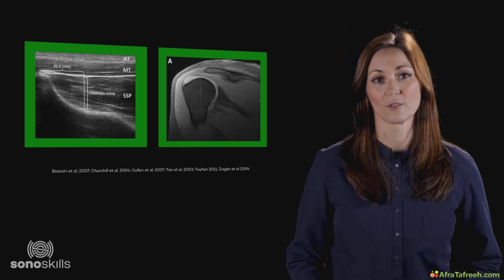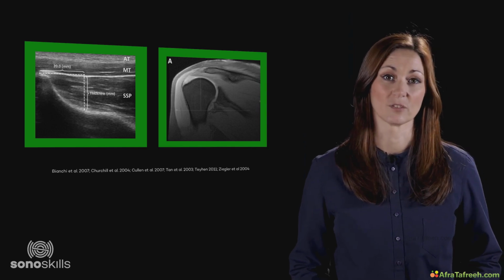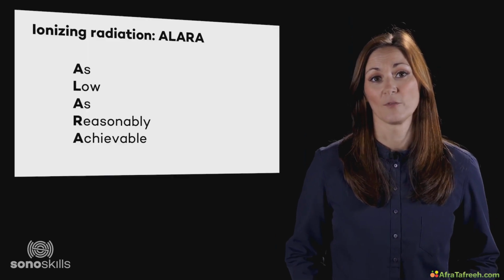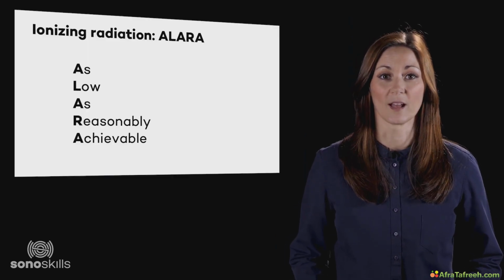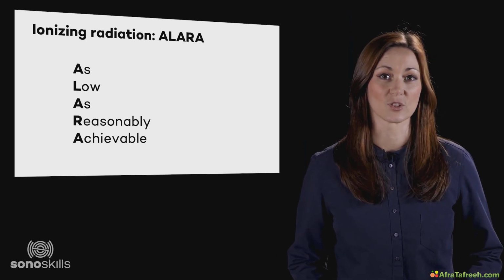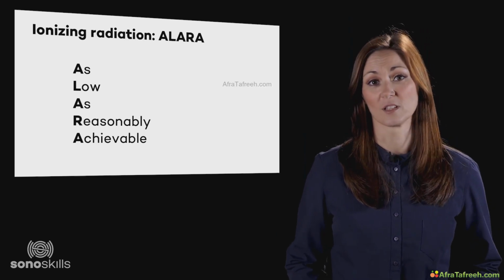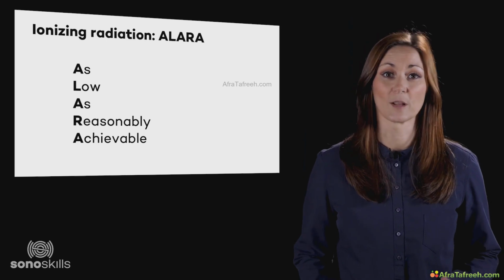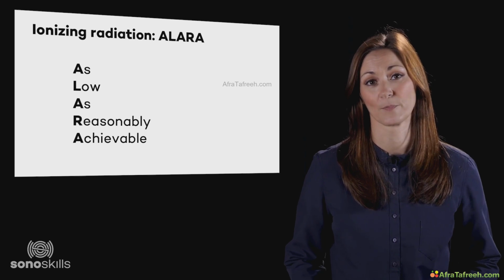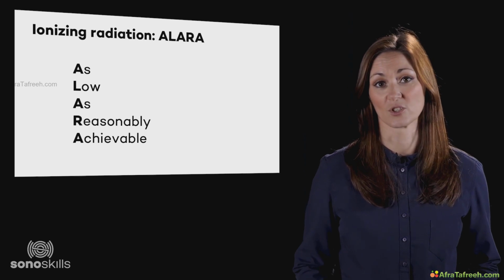Both MRI and ultrasound are very safe methods of medical imaging without any damaging or ionizing radiation. You can always use musculoskeletal ultrasound. However, in some cases, we suggest to work with the ALARA principle when scanning with ultrasound. ALARA is an abbreviation for as low as reasonably achievable, meaning that there are no contraindications, but in certain cases, it's better not to scan that particular region more than is medically absolutely necessary. This applies to, for example, malignant tumours, bone fractures, and pregnancy.